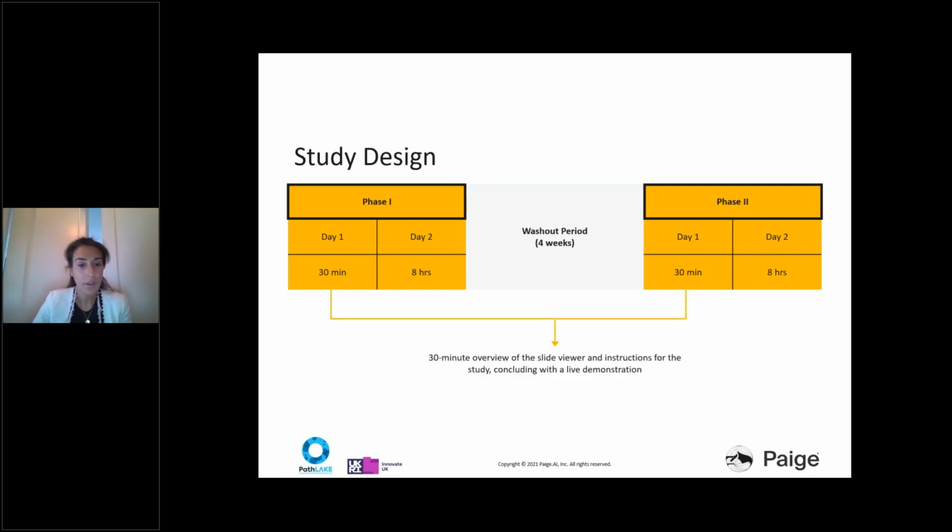Day 1 of both phases consisted of an overview of the slide viewer, instructions of the study, and a live demonstration. So we walked participants through how to analyze and view a whole slide image in the viewer. The second day in both phases is what varied.